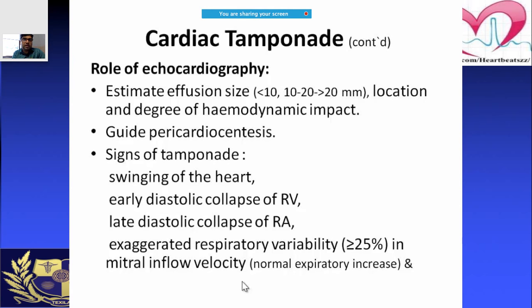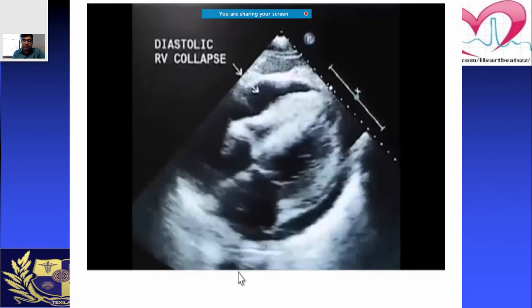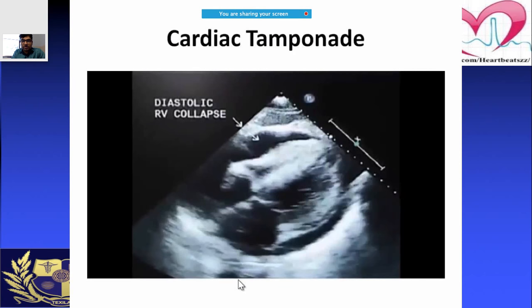Exaggerated respiratory variation is defined as more than 25% variation in mitral inflow velocity. On echo, during diastole — the relaxation phase — if there is RV collapse, that is a sign of tamponade. You can also see fluid accumulation around the heart leading to cardiac tamponade.